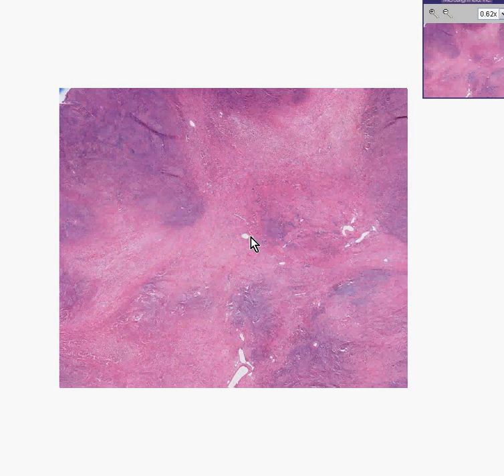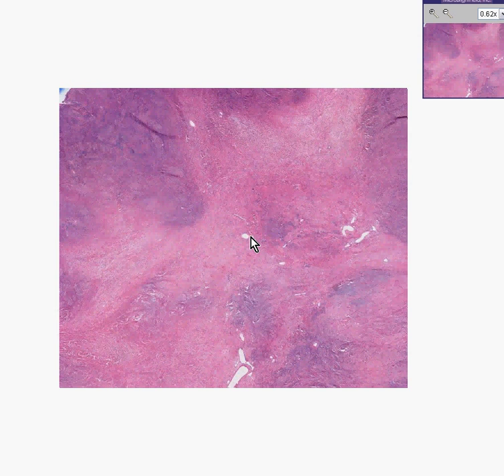Here is our last ovarian tumor. We have seen examples of epithelial or Mullerian-derived tumors, which can be both benign and malignant. We have seen several examples of germ cell tumors, which can be both benign or malignant. And now we have an example of the third general classification of ovarian tumors, the so-called stromal tumors. Stroma consists of spindly connective tissue cells forming the actual matrix of the ovary, enclosing the follicles, and so forth.